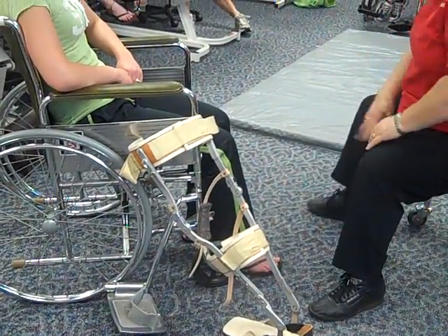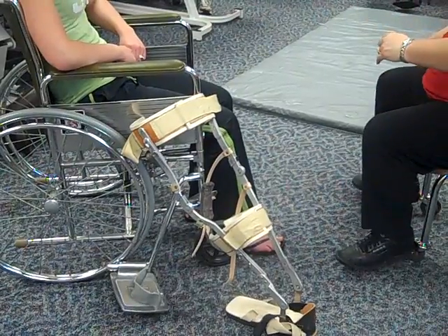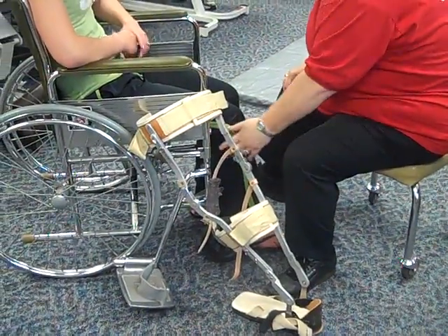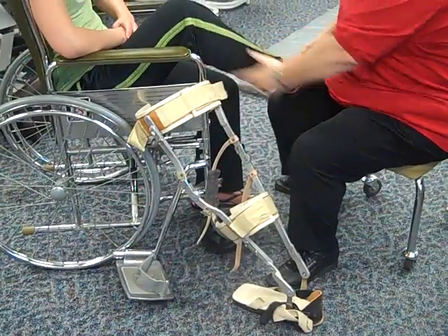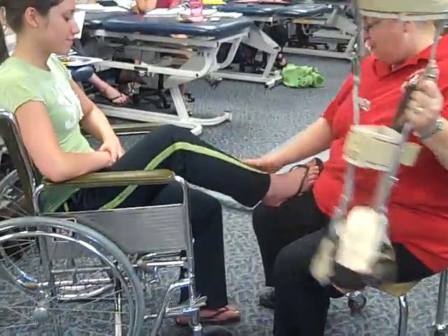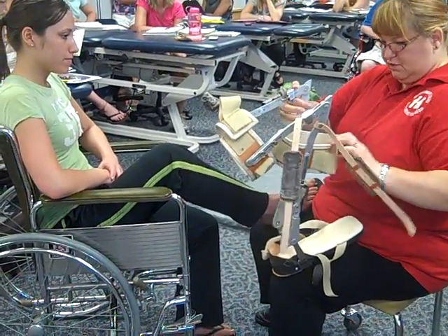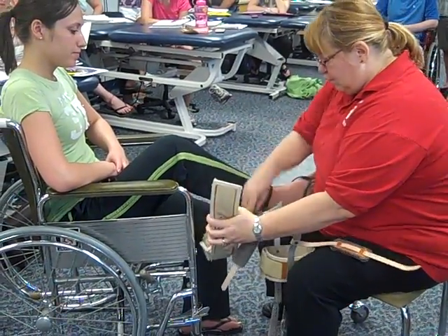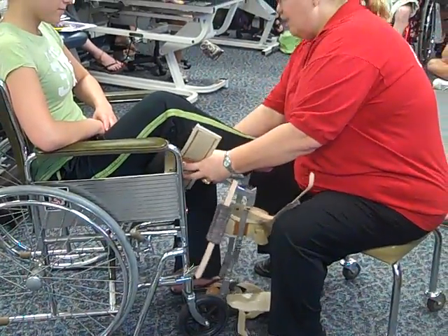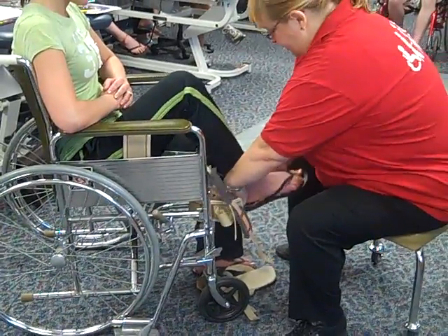Notice when I'm sitting on the stool that I put the corner in the front. That way you have room to move. If you sit on these stools square, they run into your heel. So sit on them with the corner just like that. I'm going to bring your foot up — of course we would have nice sturdy shoes on. I can control her leg position pretty well by just putting her foot on my knee. I'm going to unlock the knee, get all the straps out of the way, and push this up fairly high up under her thigh. Then I will place her foot into it.